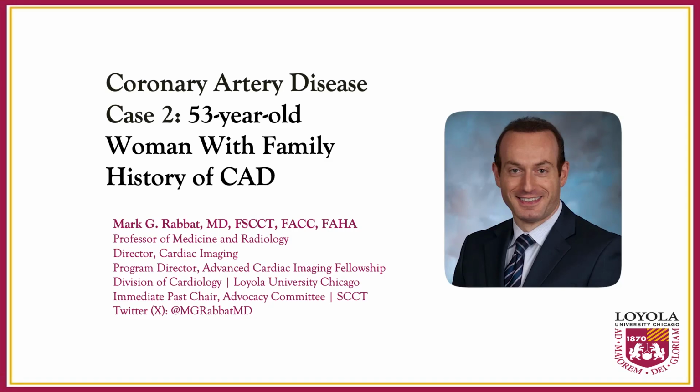I'm a professor of medicine and radiology and the director of cardiac imaging, as well as a program director of the Advanced Cardiac Imaging Fellowship at Loyola University in Chicago, and the immediate past chair of our advocacy committee of the Society of Cardiovascular CT. Today, I would like to present three different cases on utilizing CCTA and HeartFlow's AI to inform coronary artery disease diagnosis and management.